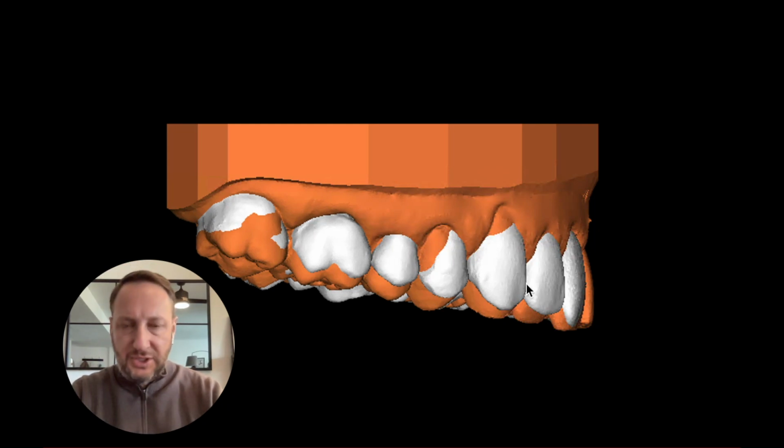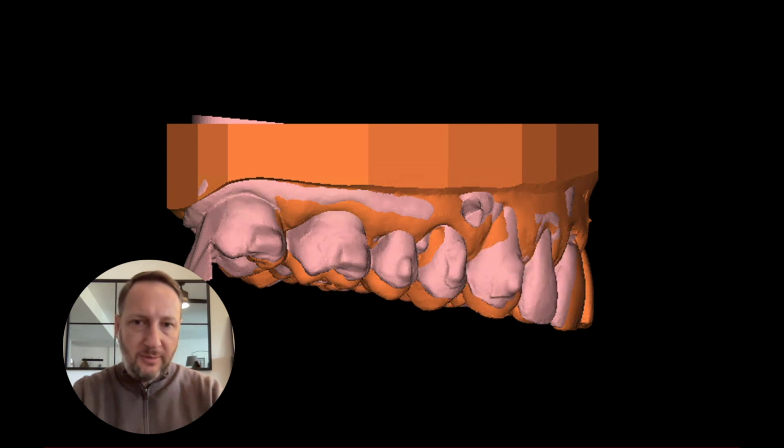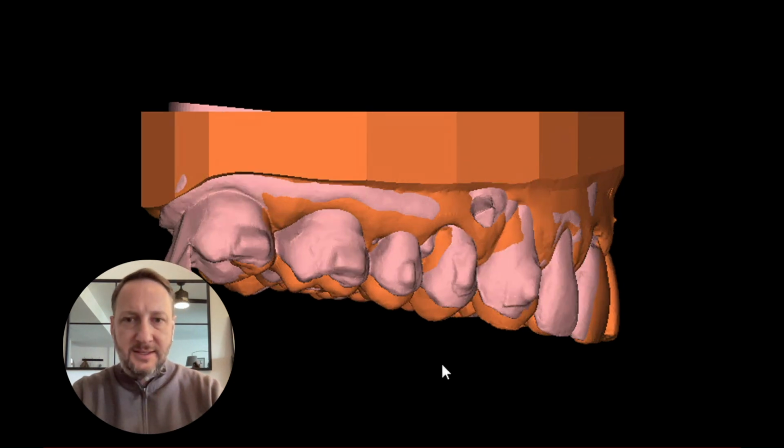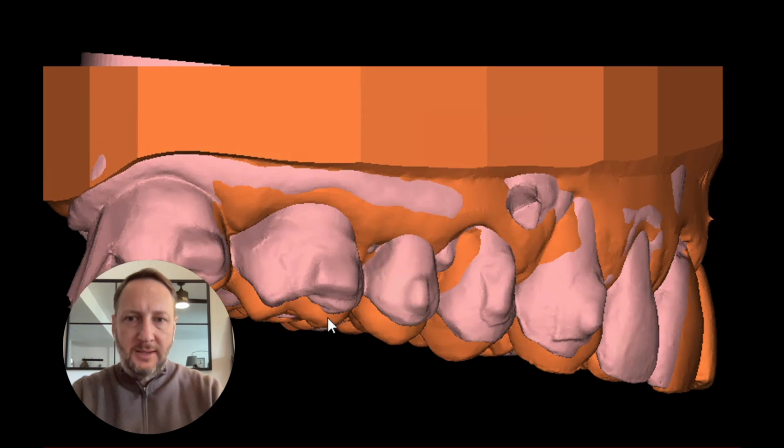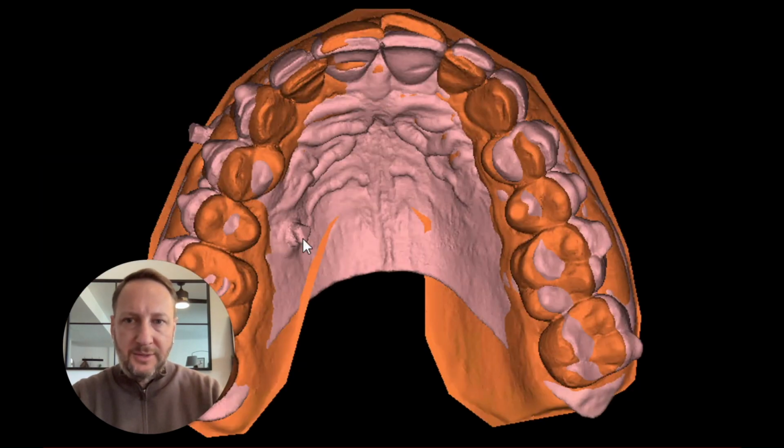The design never changes, here in white, and it's guiding everything we're doing. And now we have the final position after the first set of aligners. Let me remove the design for a while so we can see the huge difference we had in this first quadrant in terms of intrusion. So with the use of the TADs, we can see one here, and the other one in the palatal, where it was planned, where you saw in the guide that I just presented to you.